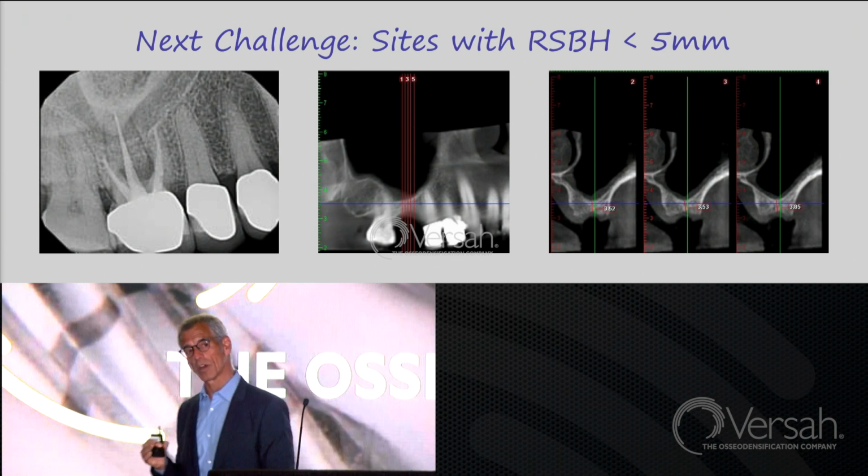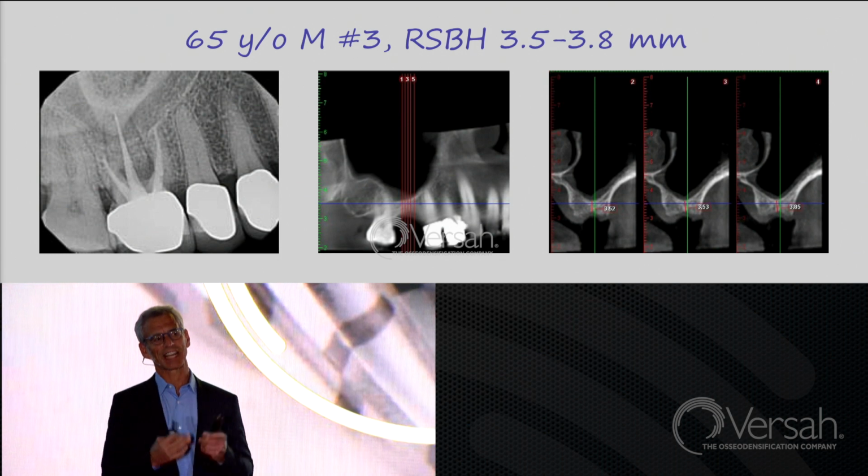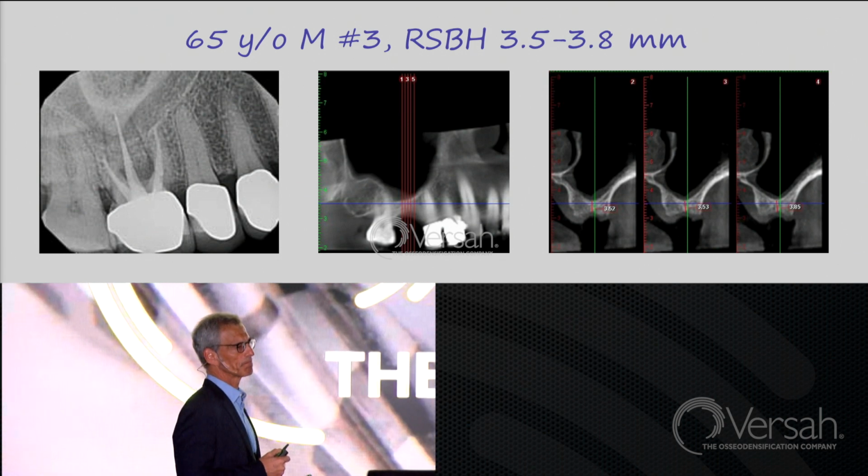The next challenge was, can osseodensification outperform an osteotome at sites where I have less than 5 millimeters of subantral bone?